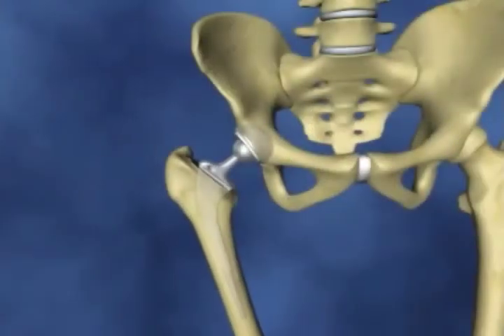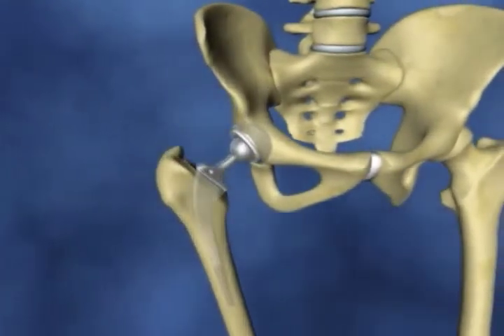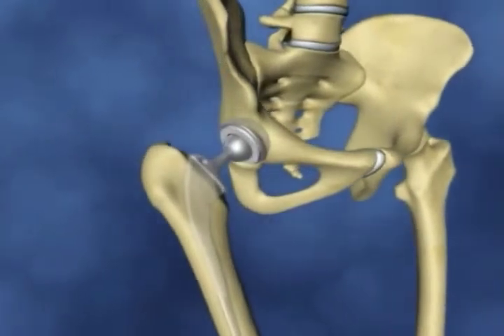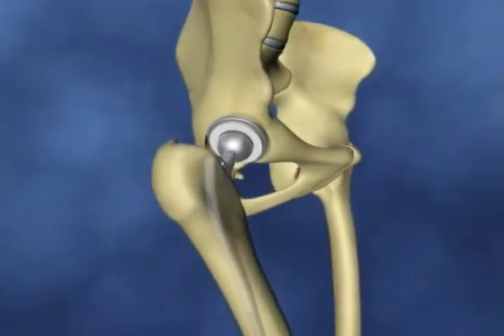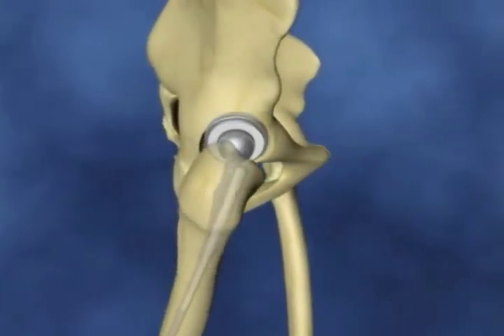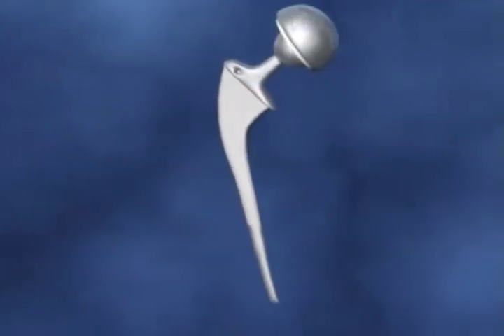A total hip replacement replaces the damaged or worn out hip joint. The new hip joint surgery, if successful, will help to relieve your joint pain and aim to improve your movement and mobility and thus the quality of your life. The replacement ball and socket are made of a combination of metal, plastic and ceramic materials.